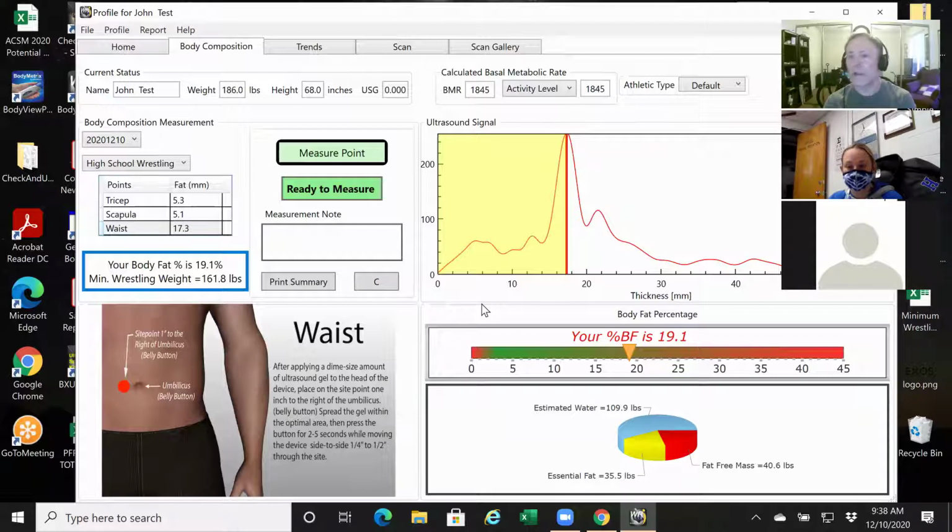So I want to talk about this outlier case in the event that it comes up for you. So number one, he told me that because he had a protruding abdomen, it was hard to even get to the site point and he wasn't quite sure what to do. You guys, Nick and Courtney, I have no doubt that you are phenomenal with your athletes and your kids.